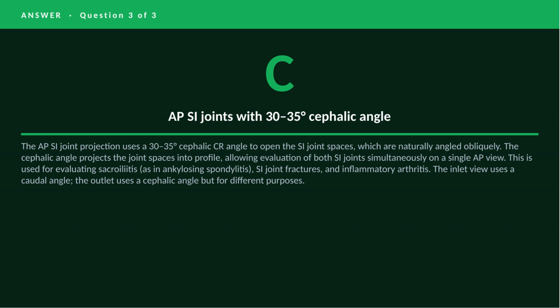The inlet view uses a caudal angle. The outlet uses a cephalic angle, but for visualizing sacral foramina and vertical displacement, a different purpose.